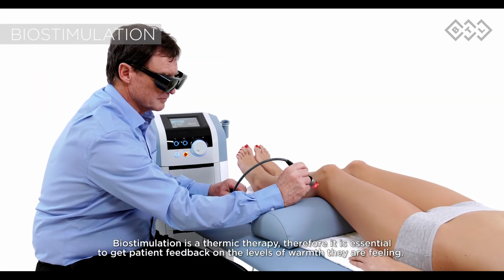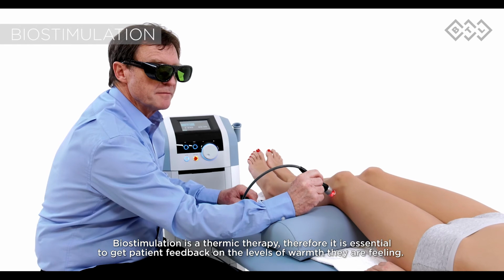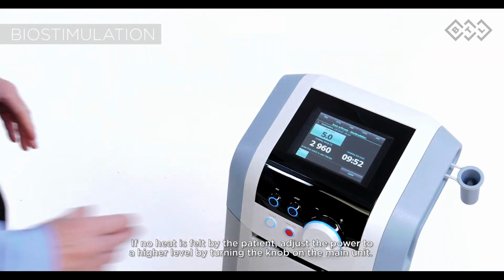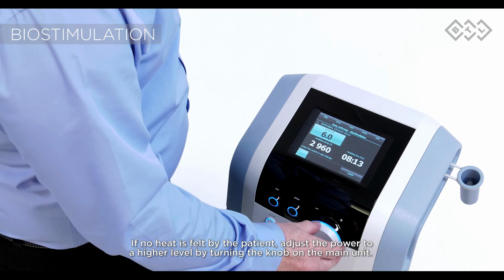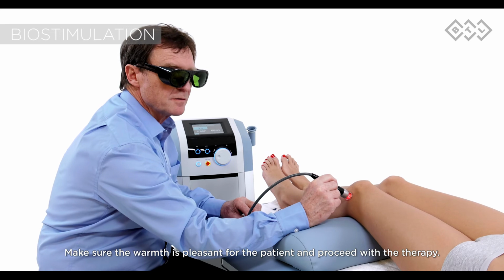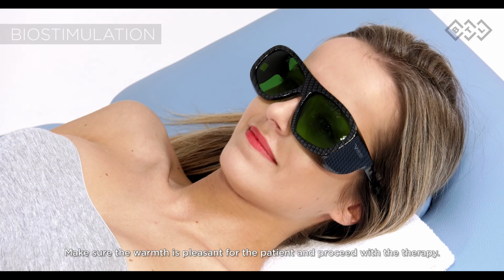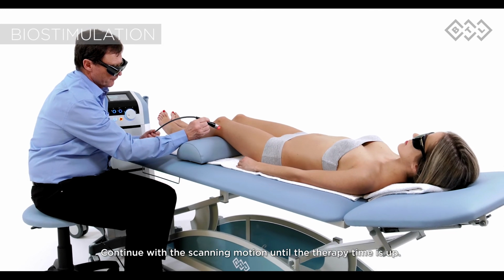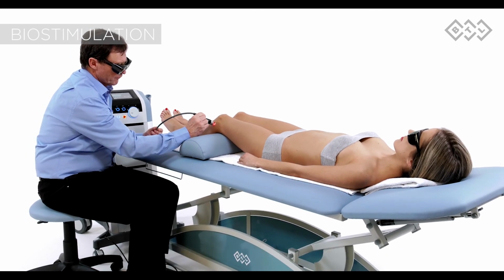Biostimulation is a thermic therapy, therefore it is essential to get patient feedback on the levels of warmth they are feeling. If no heat is felt by the patient, adjust the power to a higher level by turning the knob on the main unit. Make sure the warmth is pleasant for the patient and proceed with the therapy. Continue with the scanning motion until the therapy time is up.